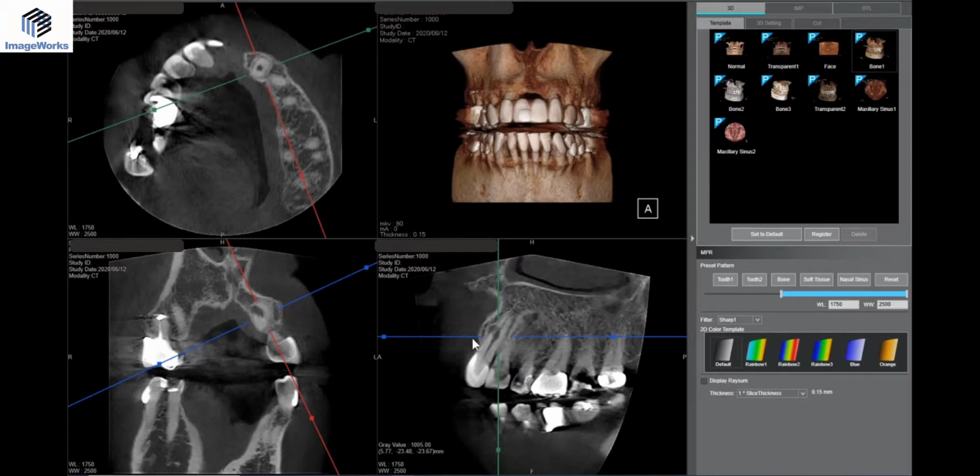This was interesting because he didn't want to lose his tooth. It's supporting his bridge, and he's not really young, so he said, "Can't you do anything to make this work?" I said, okay, there are several things we can try. There wasn't much there; this was almost a separate piece. Ideally, I'd love to use the laser and root canal to the end, but I don't think I can. True enough, I got the instrument in there all the way to the end once or twice, but it's like shooting through an open space and you can't get it.